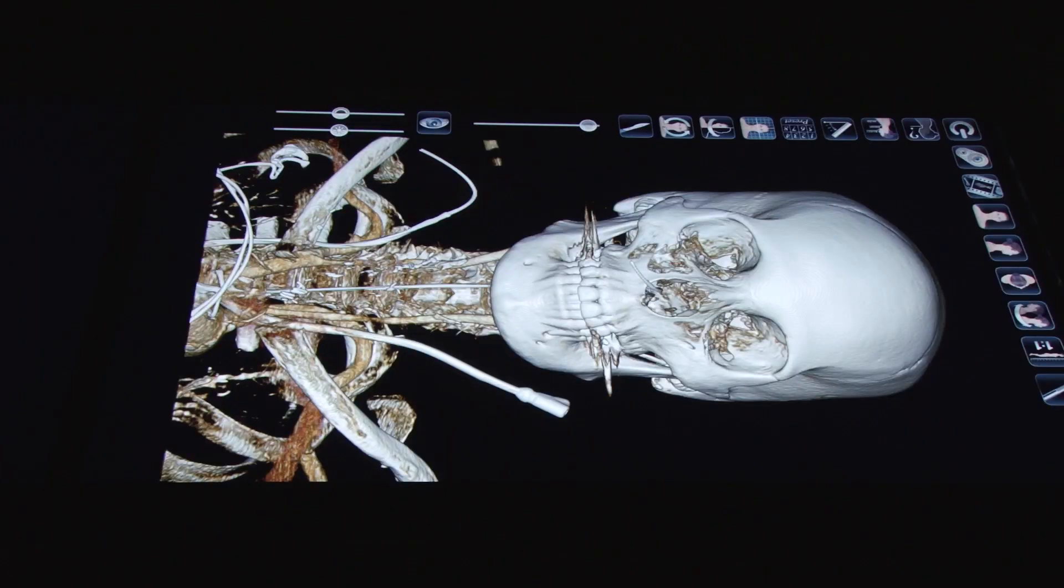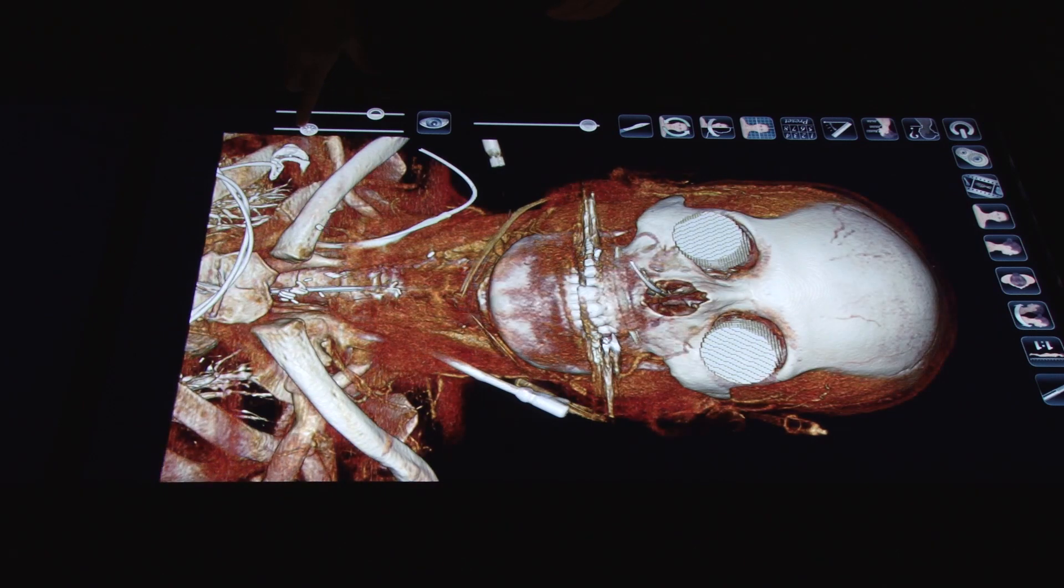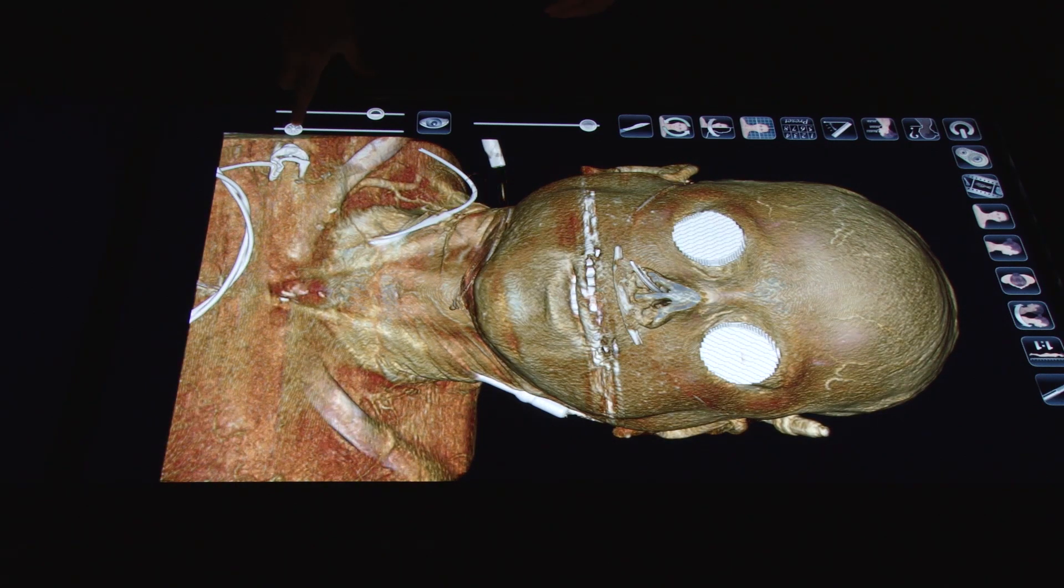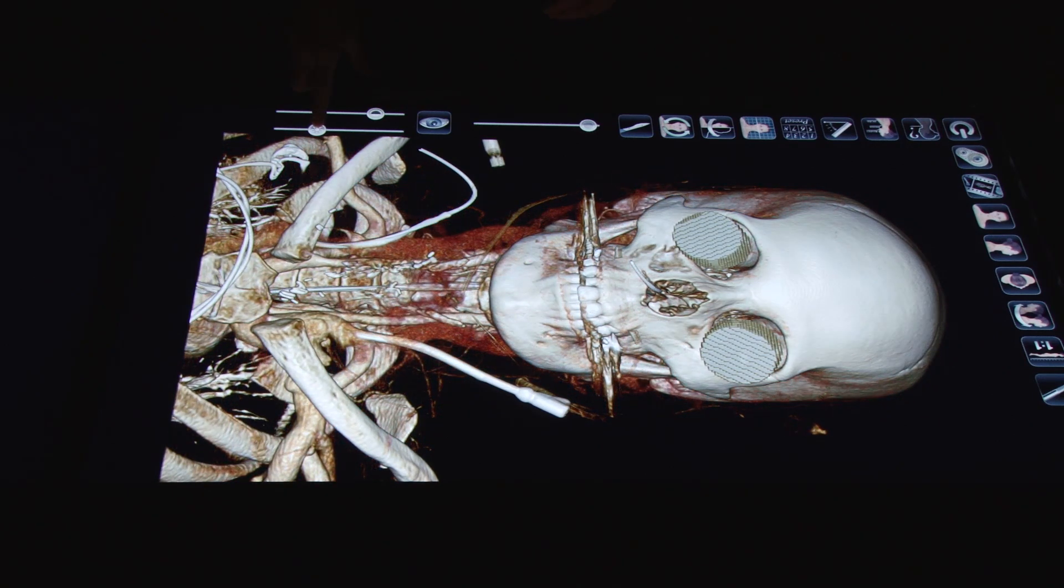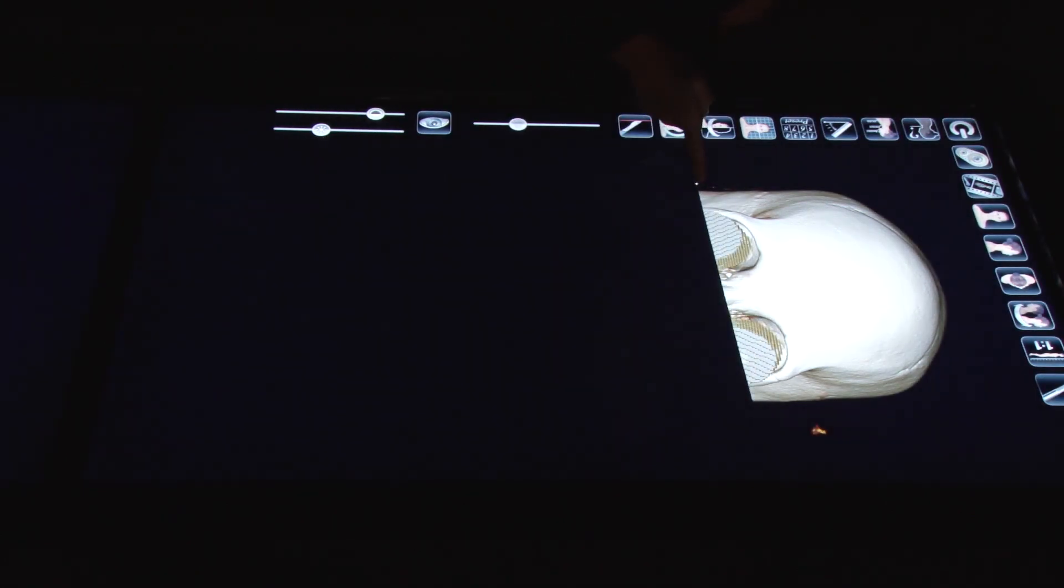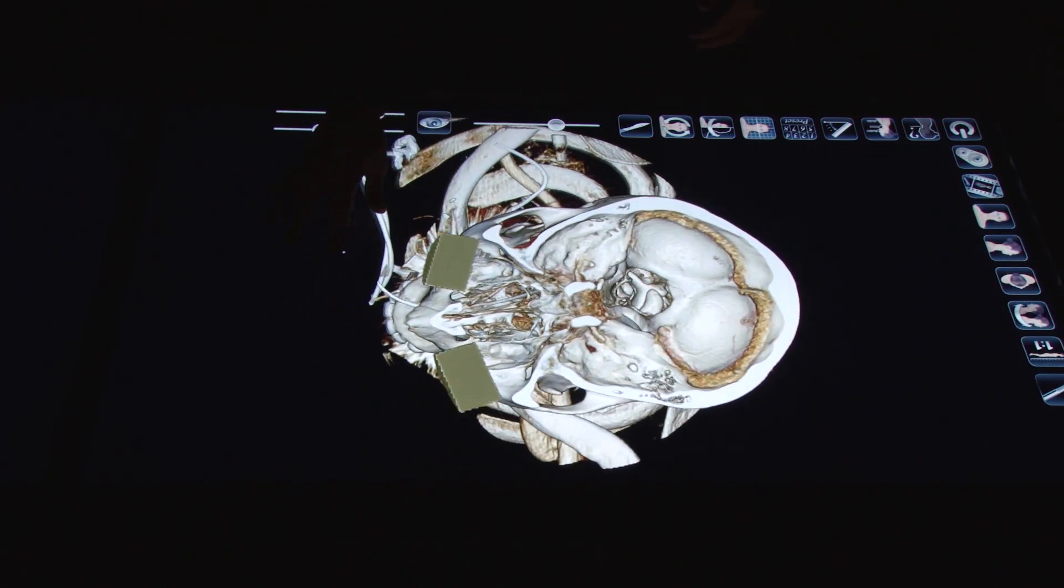Medical schools and hospitals currently utilize the Anatomage table for on-the-job training and for loading pathologies and viewing scans. Our table comes complete with 100 pathological scans fully rendered so that you are able to add tissue through changing contrast and pull tissue away in order to locate the pathological condition on these scans. The case studies include histories and outcomes for these patients.